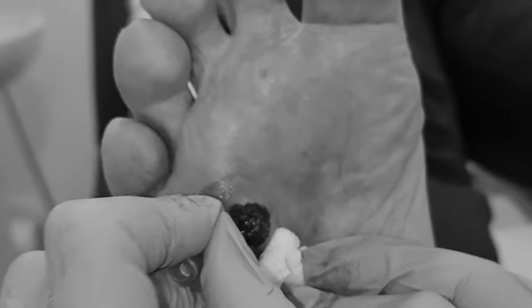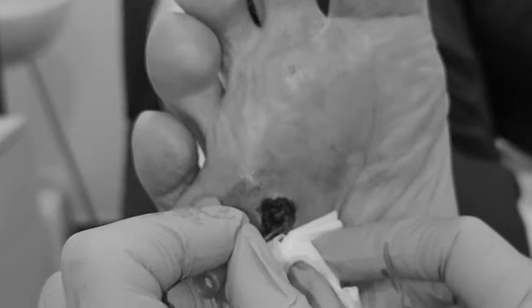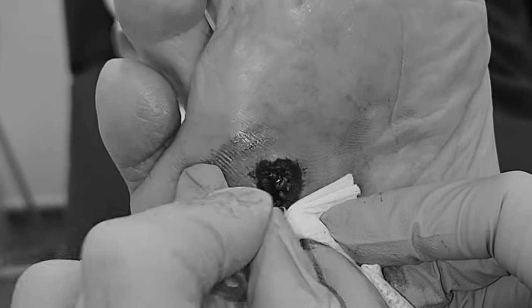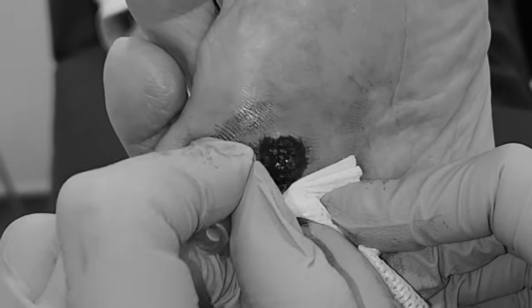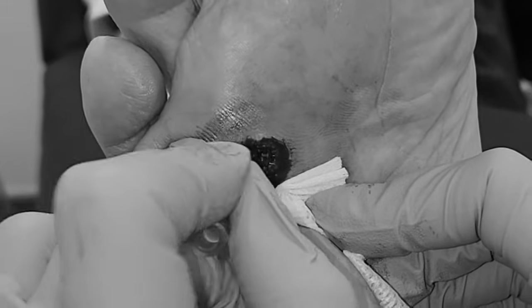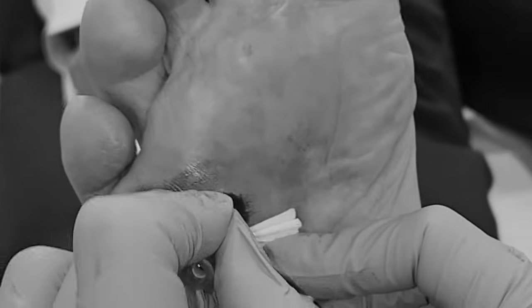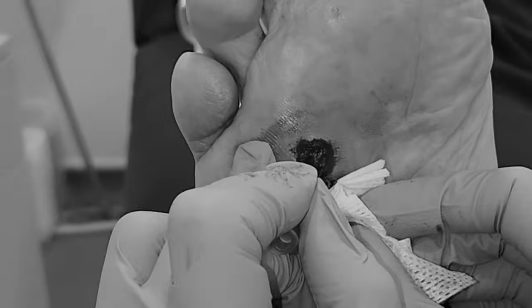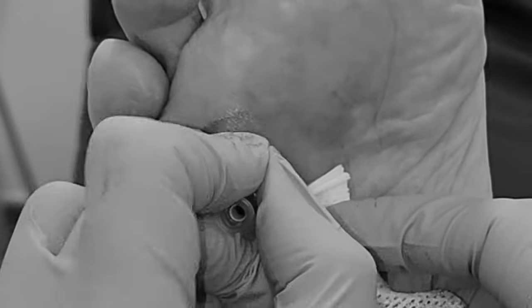So it's now, and you can see it's a lot more macerated. This gauze is just to hold the bleeding. I was just talking to Saha about making sure that your hands are away so that you don't cause yourself a sharp injury, because it's quite a repetitive movement, so you can easily stab yourself. So just be mindful to have your fingers away. I'm using my pinky to anchor it, because it just makes it easier to needle it down.